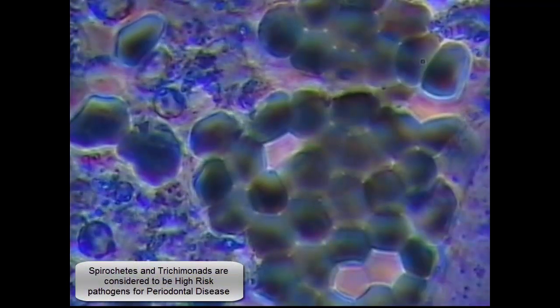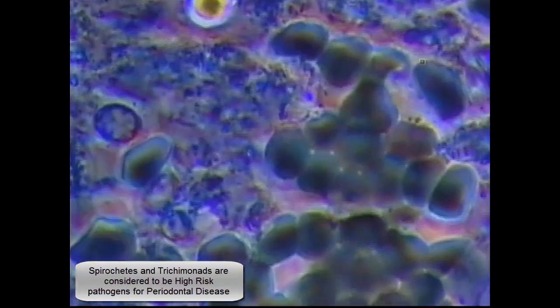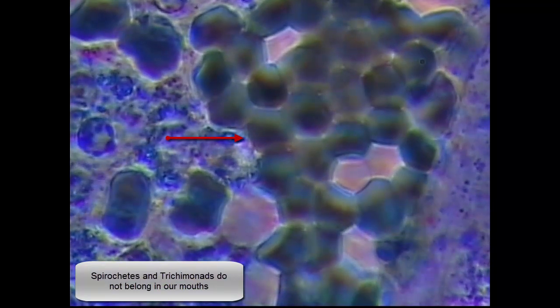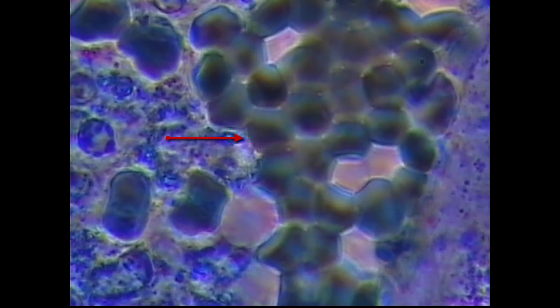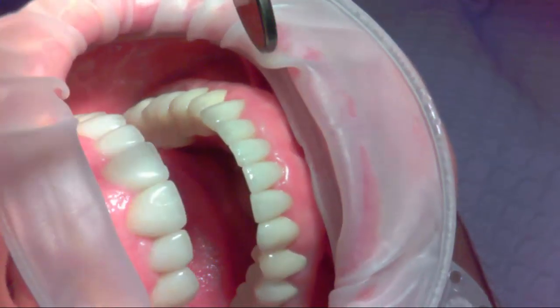On the same slide, taking a closer look at this group of cells, these are actually trichomonads that are clustered together. They're usually not like this — they're more often found by themselves. So after exhausting everything, the patient decides to move forward and opts for laser treatment.